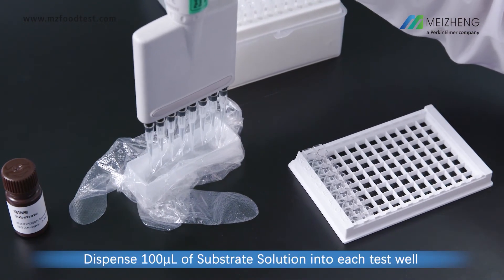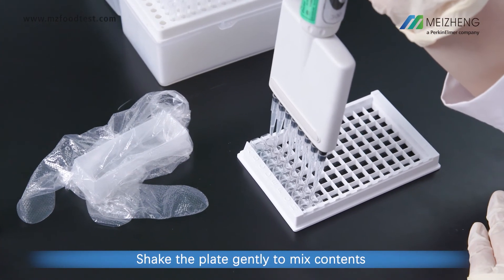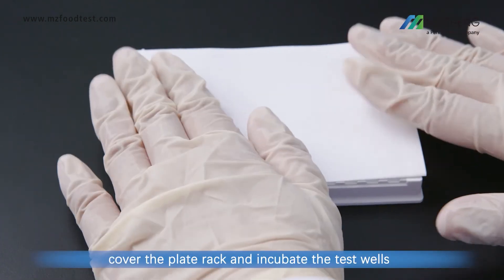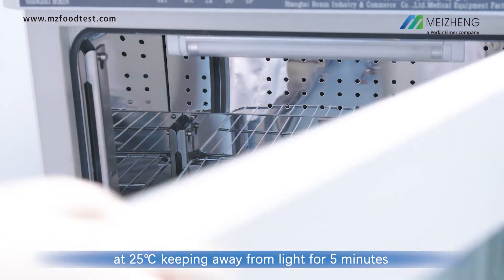Dispense 100 microliters of substrate solution into each test well. Shake the plate gently to mix contents. Cover the plate rack and incubate the test wells at 25 degrees Celsius, keeping away from light for 5 minutes.